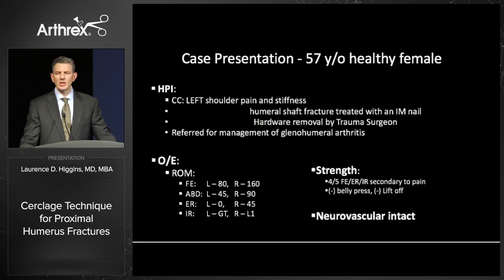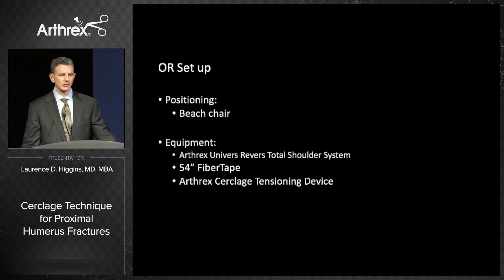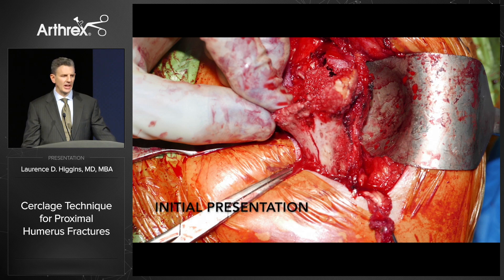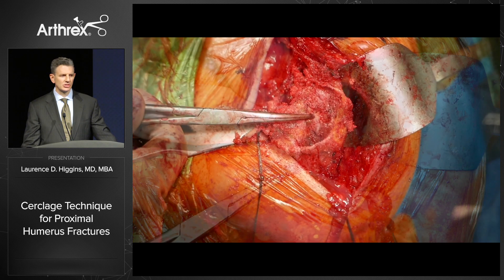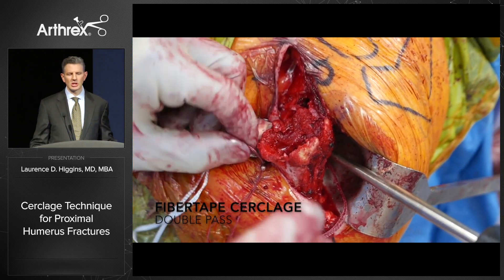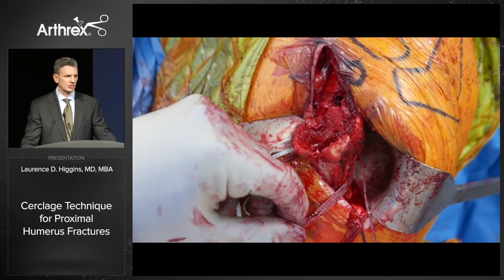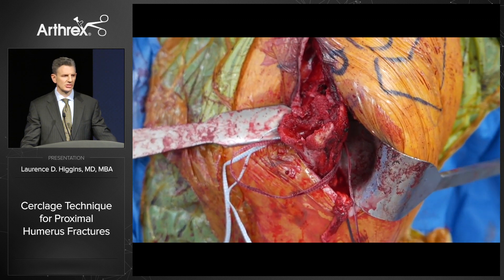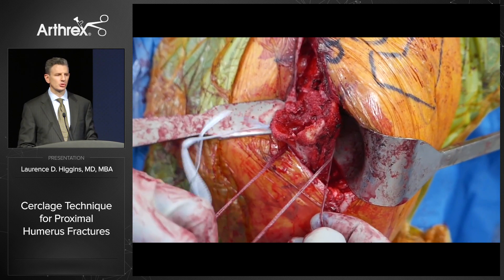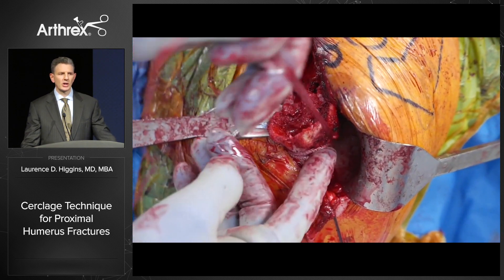This 57-year-old female had very poor active motion, only able to actively forward flex to 80 degrees. We planned a reverse arthroplasty with bone graft and a fiber tape cerclage. When we were instrumenting her canal, we could see a crack in her calcar and the quality of her bone. We passed a double fiber tape cerclage using a bone passer — the kit coming out has all of these instruments so you can do this with a simple set. We pre-tensioned the suture to eliminate slack and passed it around the canal twice.